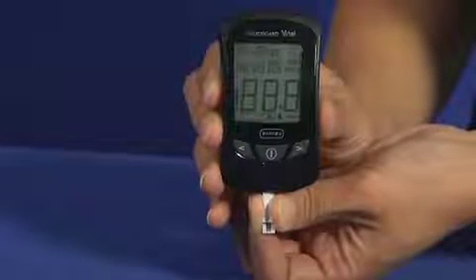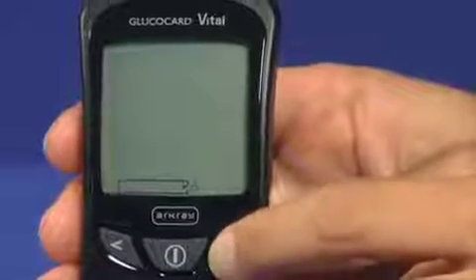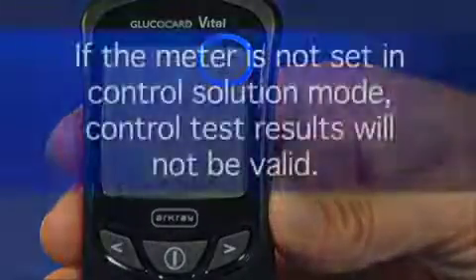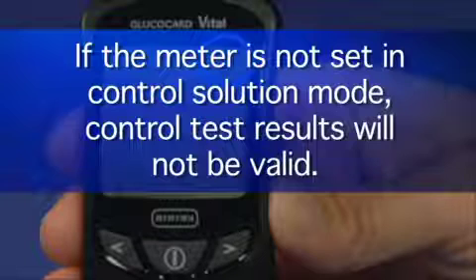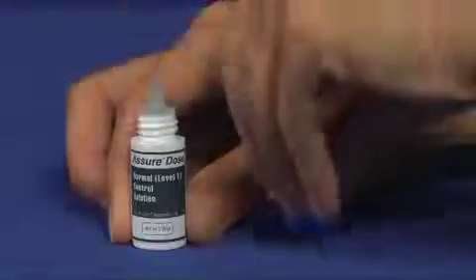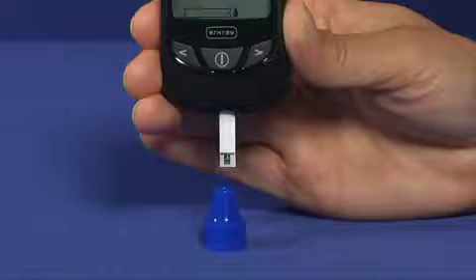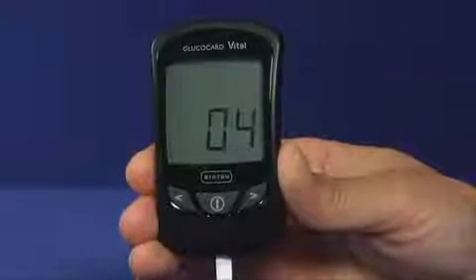Begin by inserting a test strip into the meter. To enter control solution mode, press the back or forward button until the control solution bottle symbol appears in the upper right corner of the screen. If the meter is not set in control solution mode, control test results will not be valid and the test will not be marked as a control test in the system. Begin by gently inverting the control solution bottle several times to mix. Remove the cap and place it on a flat surface. Squeeze the bottle and discard the first drop of solution. Apply the second drop to the top of the cap. Bring the meter and test strip to the drop of control solution — using capillary action, the test strip will draw up the solution.